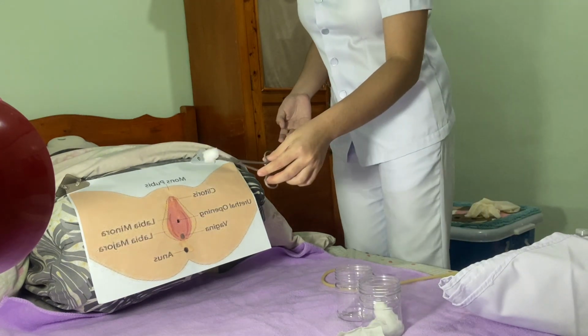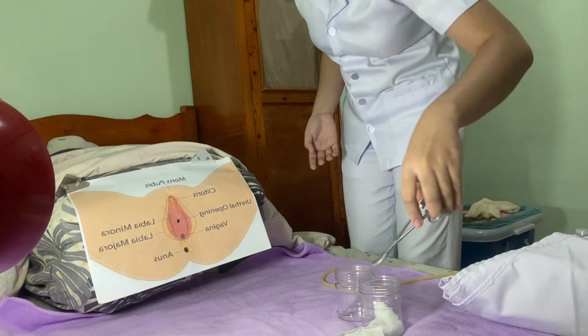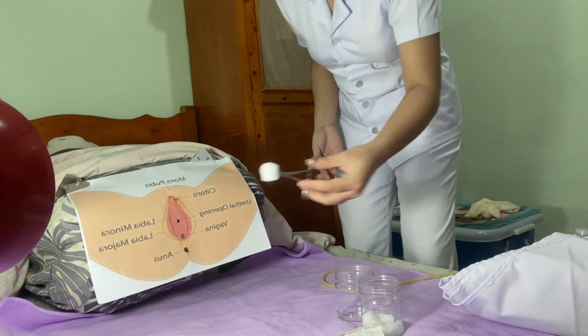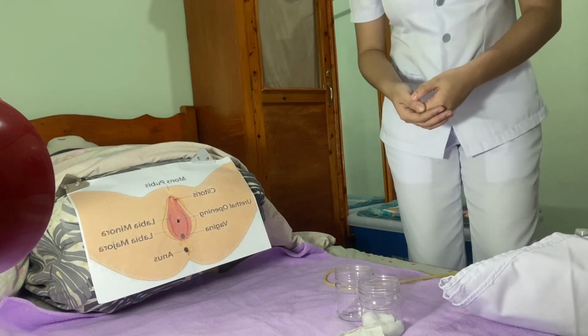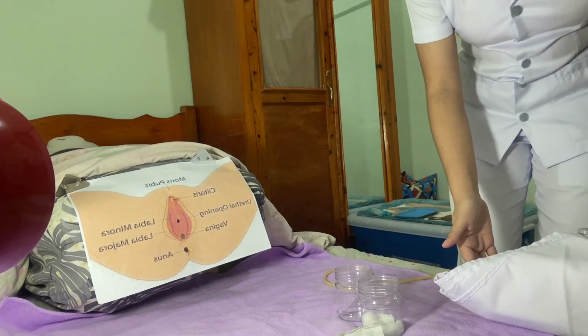So now let's proceed to the labia minora, and discard, and then another cotton ball, and discard. So now we have to open the set and observe sterile technique. So now I'm gonna open it.